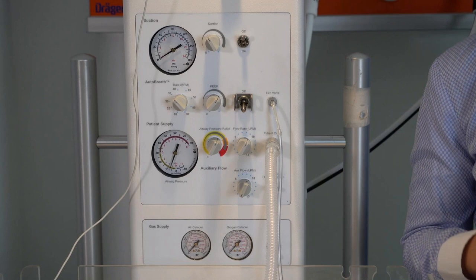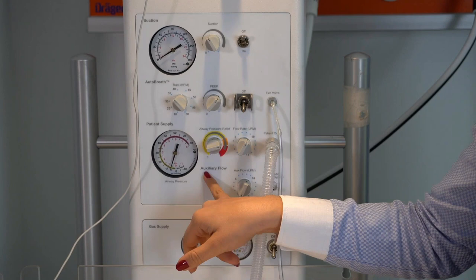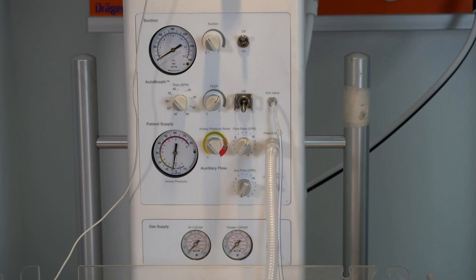Also, you can control the airway pressure delivered. So if I now increase the pressure, we see that we go much higher. And if I now reduce the pressure, the pressure delivered to the patient is minimal.